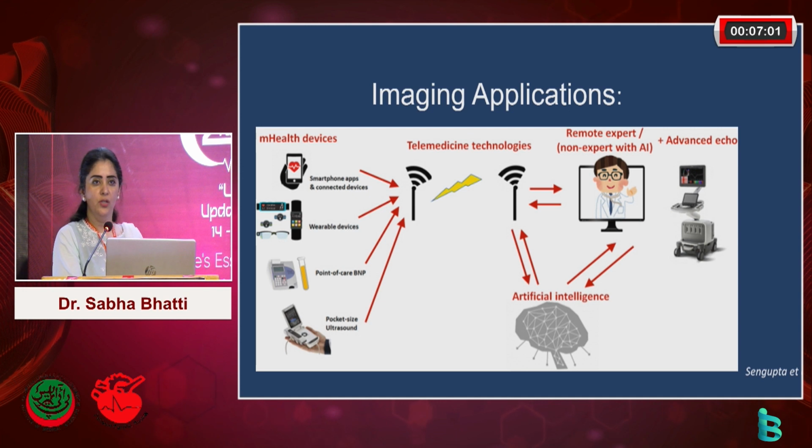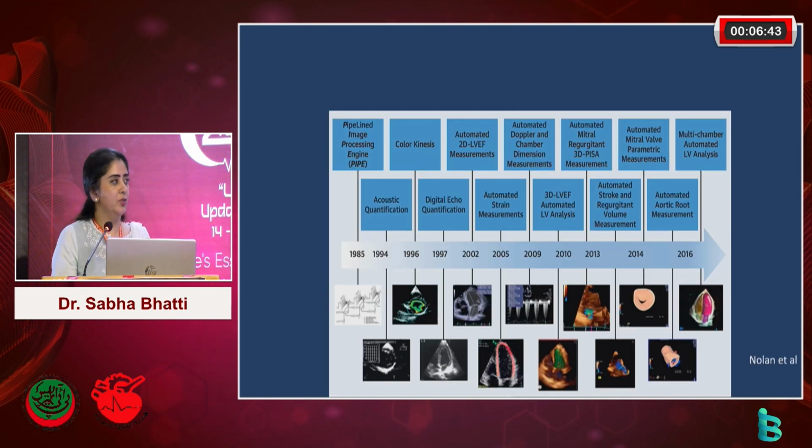And in some institutions, in some countries, they've looked into this. If a patient needs a follow-up, can they go home with the probe, or can a community health worker or a primary care doctor help get the images? And then remotely, over a laptop, an expert can remotely help them with what they're seeing. And I'll show you some examples of that.